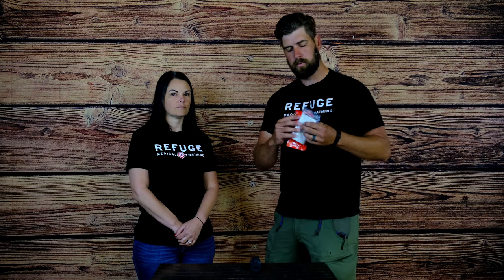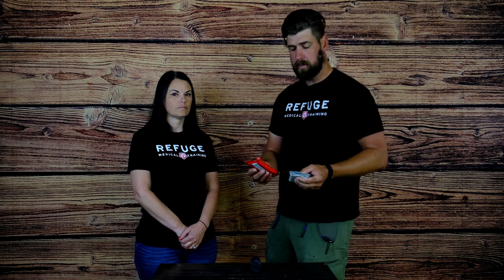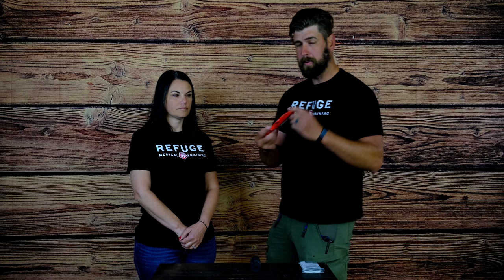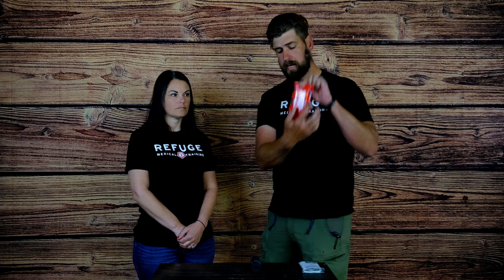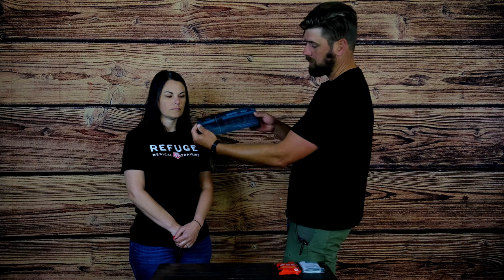I like these. One of the benefits is you can store about twice as many of them. We're going to go over the application of them. You open up your package — it has the directions on the outside of the SWAT-T, and also on the actual product itself it has the directions.